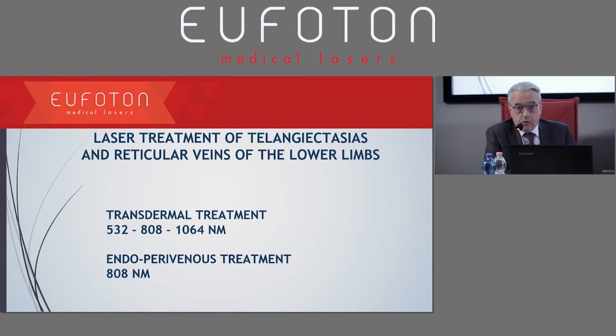So we started with transdermal lasers, 532, 808, 1064. All these wavelengths are used in the transdermal method. 532 has hemoglobin as reference point.